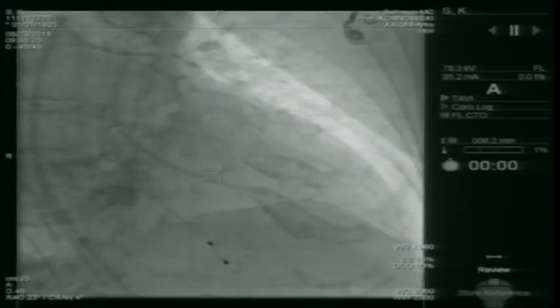And we feel very confident about the performance of the device and the valves, and we are going to show you how we position this device in the annular region, and it is a self-expandable device.